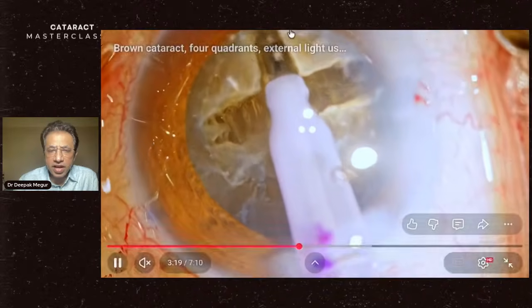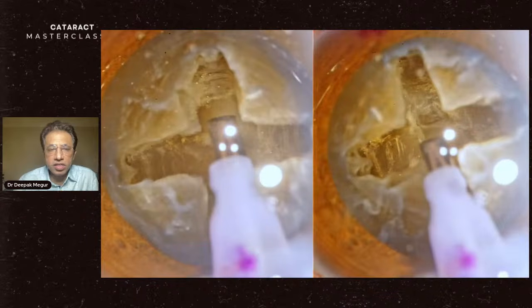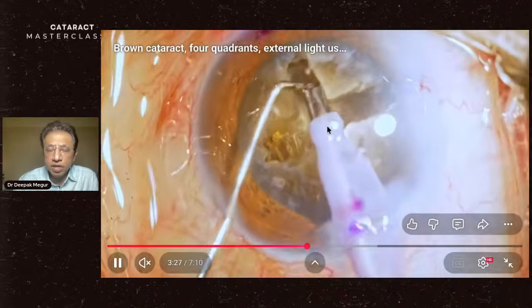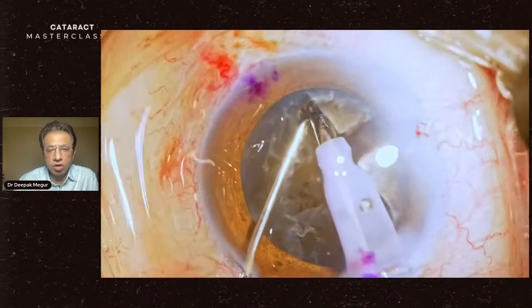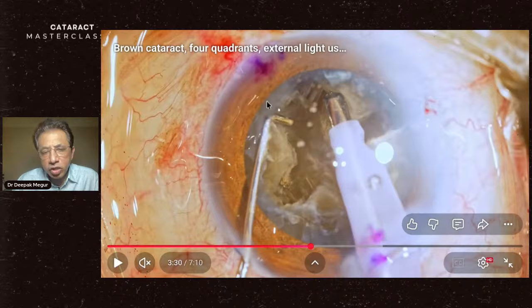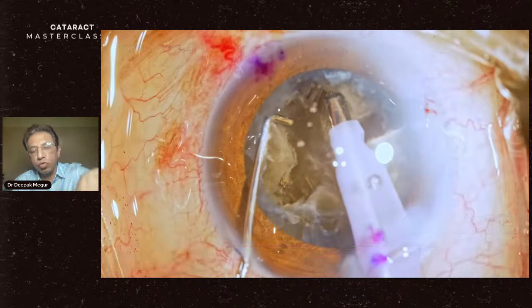And the striations at some time become a little bit fading. Okay, this is how the difference would be. Now the striations are there, but they're still not gone totally. But I am attempting a lateral separation. The second instrument which you're going to use should be slightly longer than what I'm using now, because you can reach the posterior plate much more easily.